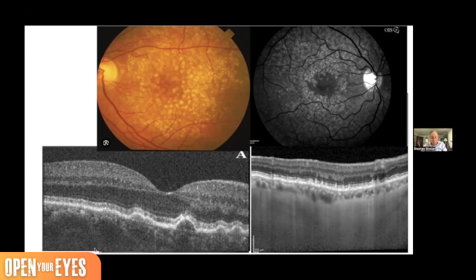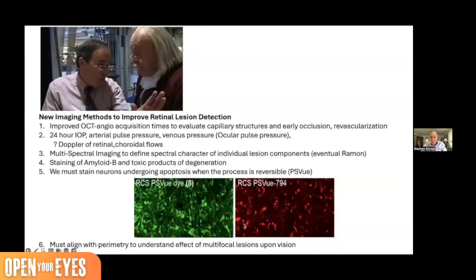Okay? So in this first picture, you see here a picture of subretinal drusen. The material is softer, clearer, or more opacified. But look here at what is ignored, the alterations of the pigment epithelium on the surface.